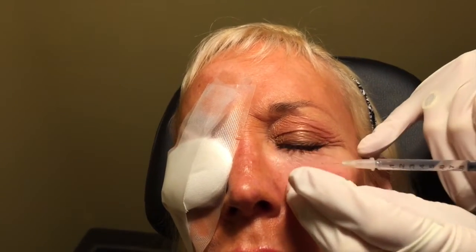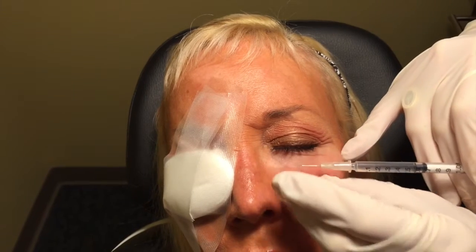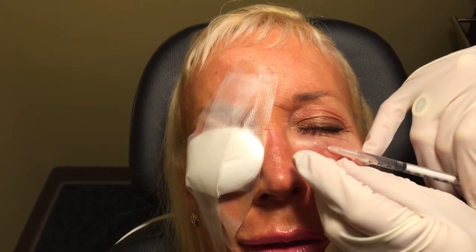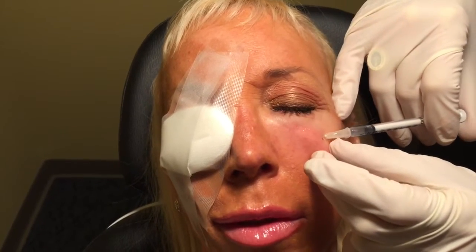Okay, wait with me here. And so we're doing this little fan pattern. And then we go a little bit up near medial. And the last part right here. Okay, so we're down there.